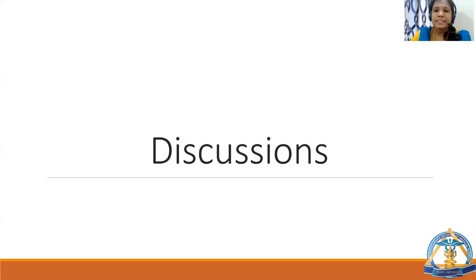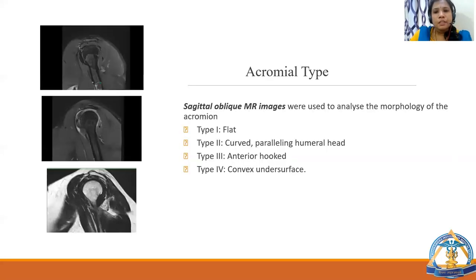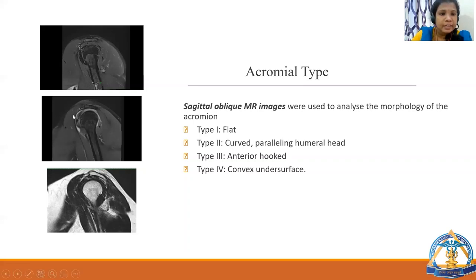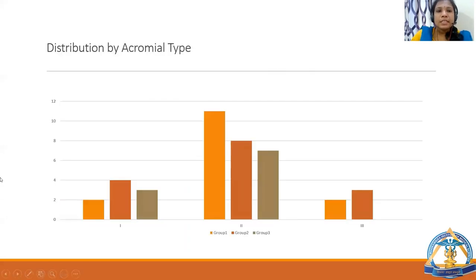In the discussion, acromial type was analyzed on sagittal oblique MR images to assess acromion morphology. Type 1 is flat, type 2 is curved paralleling the humeral head, type 3 is anterior hooked, and type 4 is convex undersurface. The graph shows distribution by acromial type across the groups.